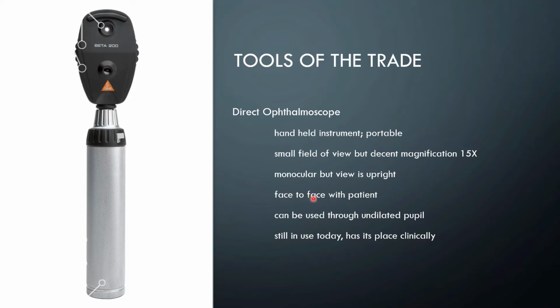You have to be face to face with the patient. I mean, very, very close. And in this day and age of COVID, that's not really all that desirable. It can be used through an undilated pupil though, and it's still in use today. It has its place clinically for a few things, but there's better tools now that we use to assess the retina for sure.